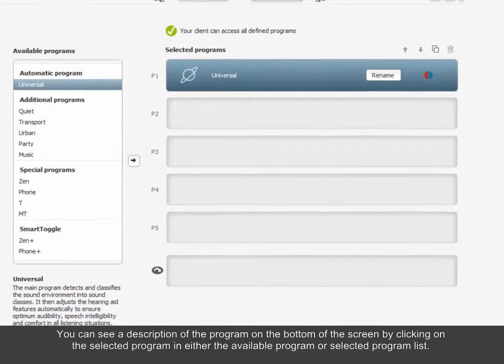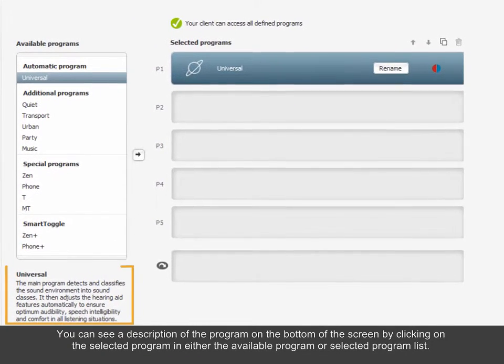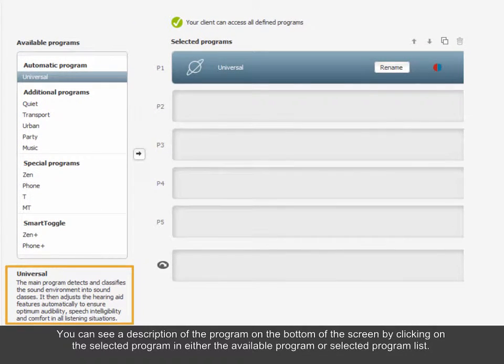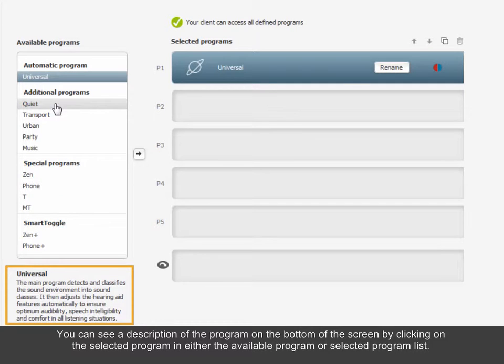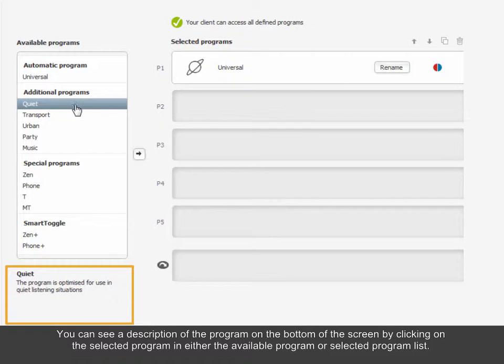You can see a description of the program on the bottom of the screen by clicking on the selected program in either the available program or selected program list.